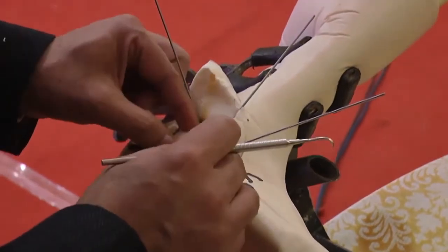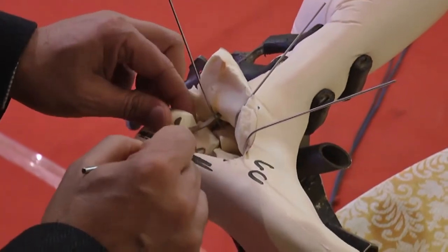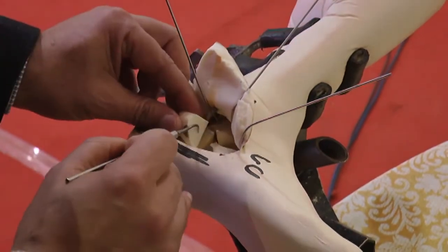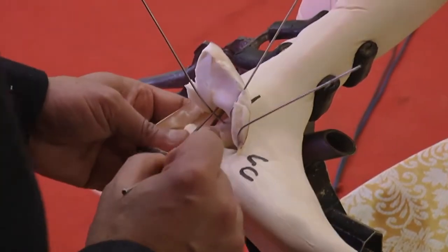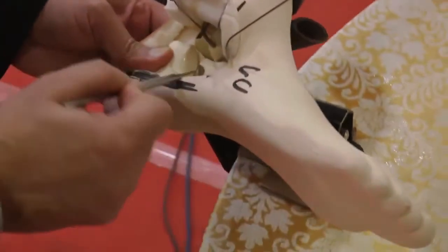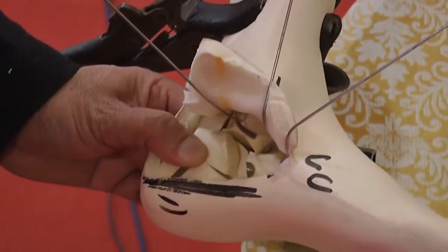So what we did was, the lateral wall blowout is on the top, like this, which is obstructing your view to the facet there. So the lateral wall has to be taken out, and then you will be able to see the fracture line there. So you see, this is the general configuration.